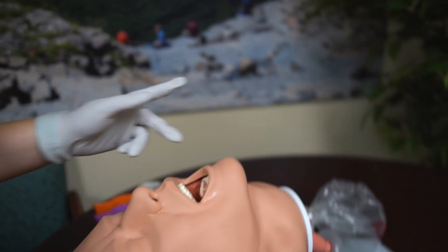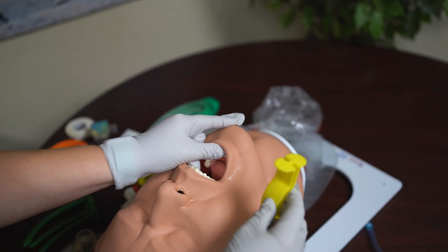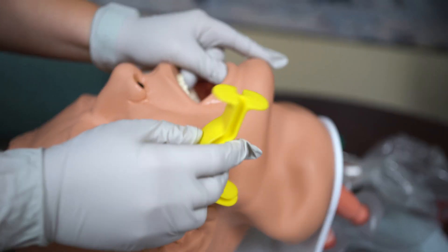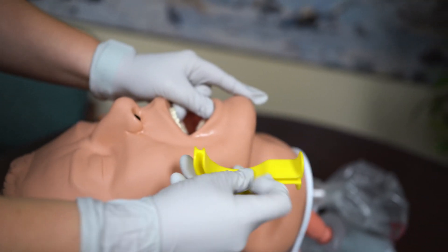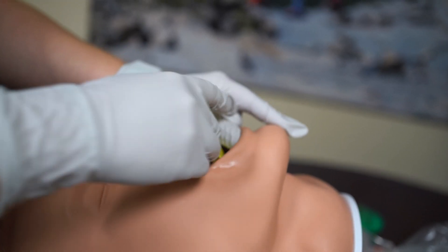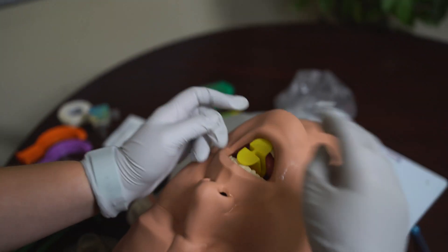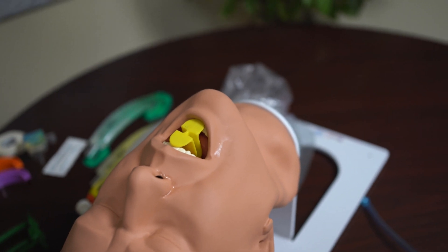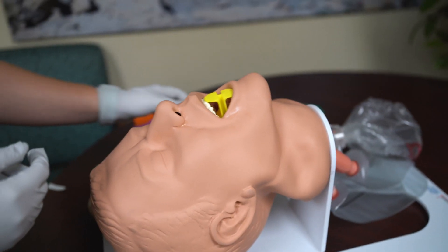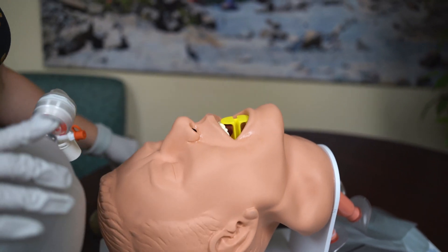I'm going to open the patient's mouth with my scissor technique. The OPA sits like this in the patient's airway, but to insert it I'm going to turn it backwards so the tip is facing me. I insert it until I meet resistance, then rotate it 180 degrees so it sits on the patient's teeth. Is there a gag reflex or does the patient accept? Patient accepts. If there was a gag reflex, I would have to utilize the NPA.